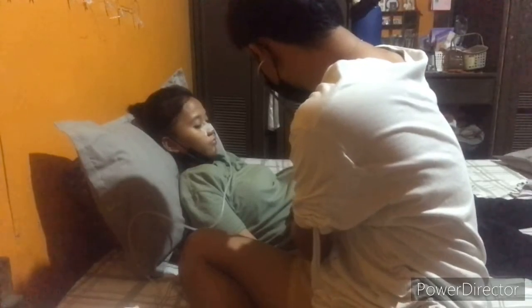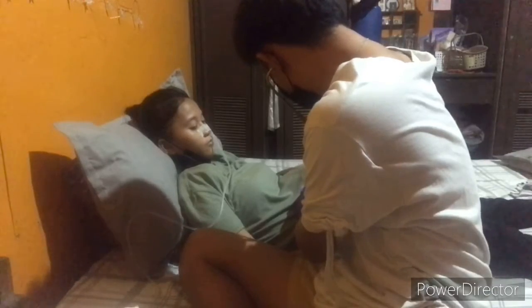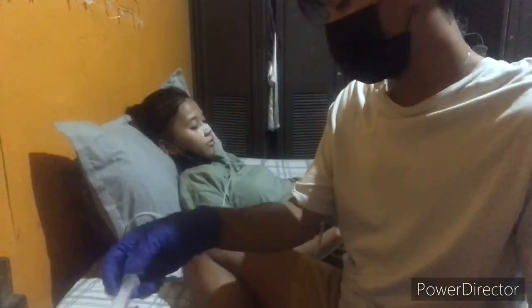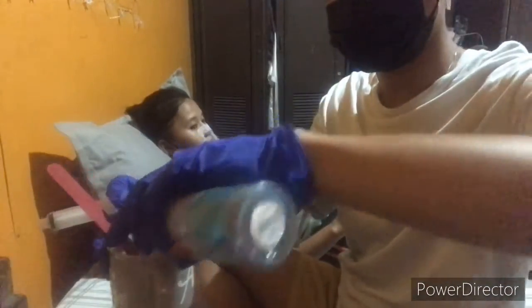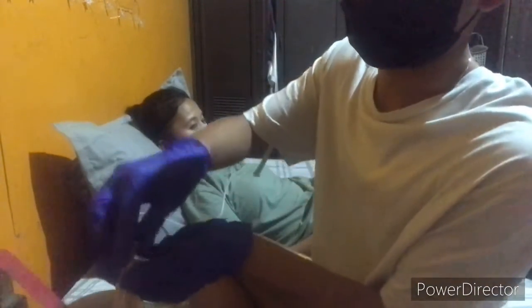Fasting gastric pH is usually equal to or less than 4. It is only infrequently greater than 6. In contrast, intestinal aspirates usually have a pH equal to or greater than 7. Gastric fluid is usually cloudy and grassy green, tan, or off-white in color. In contrast, intestinal fluid is usually deep golden yellow and clear. An aspirate with low pH and typical gastric fluid color indicates a high probability of gastric placement.